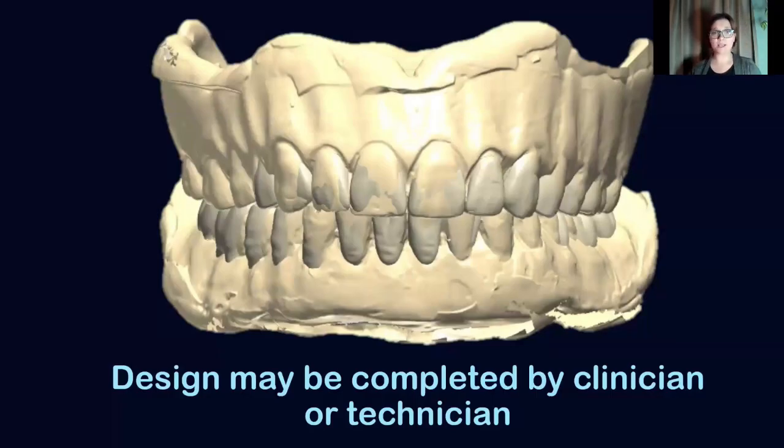Once you have your scan, all that data is digitized. Now you're going to jump into your design steps. When you do your digital design, it can be completed by the clinician if that's something you're really adept at or very interested in. Otherwise, if you're new to the process and trying to decide which workflow is for you and which steps you want to take, this is a fantastic step to delegate to a dental laboratory technician.